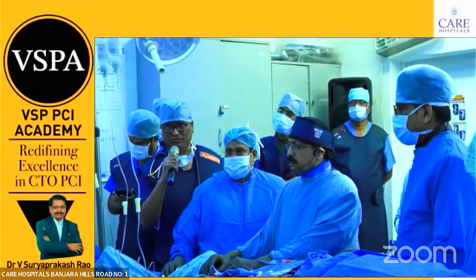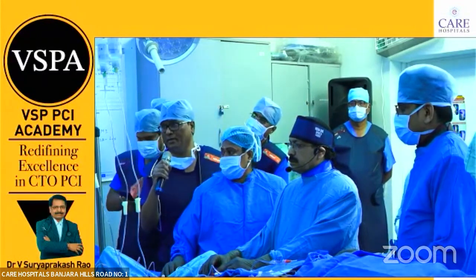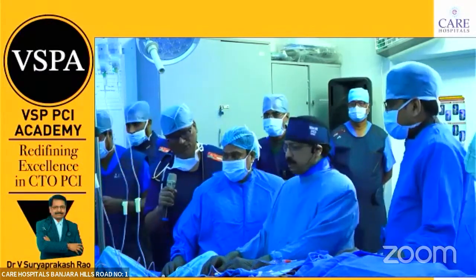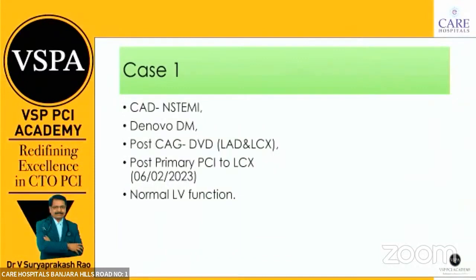The J-CTO score was 2, with a long segment of more than 2 centimeters with calcium, and with good LV function. This patient is morbidly obese, more than 100 kgs in weight, and that is one of the main issues for access. We have 7 French access on both sides. We initially kept 5 French on the left side, and we'll upgrade.